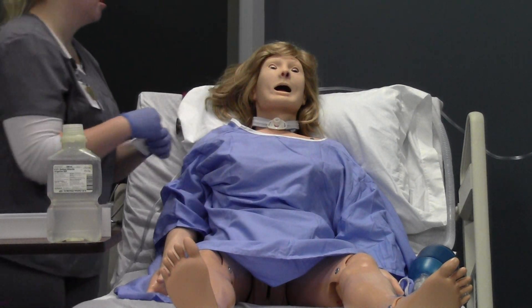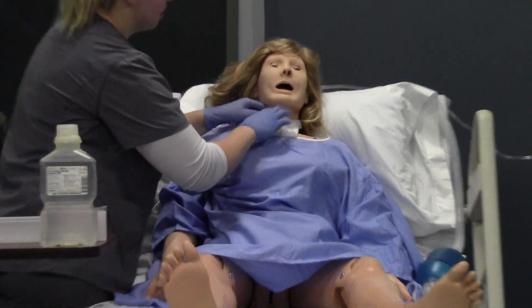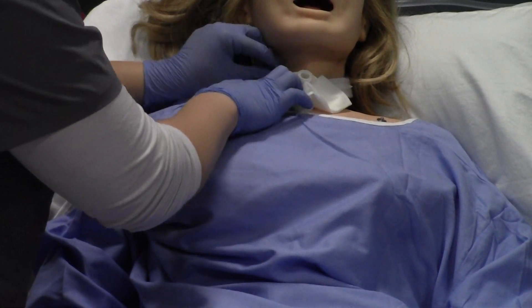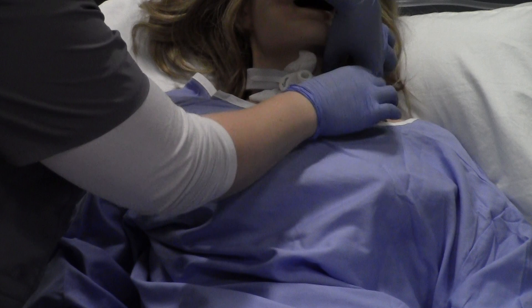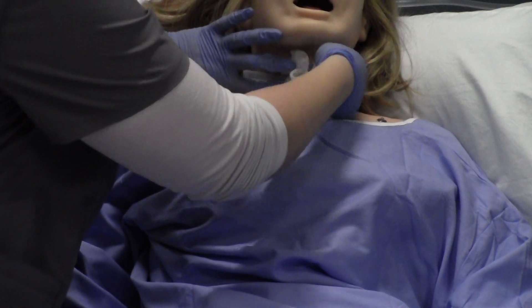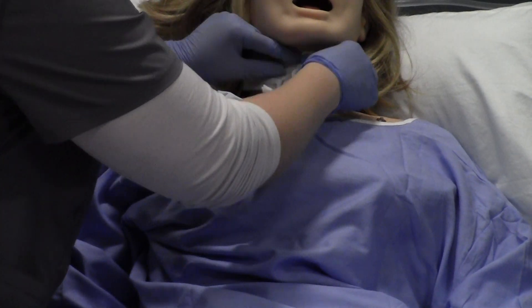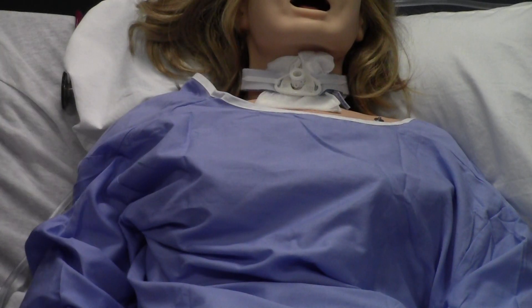I'm going to put my clean trach dressing underneath. My partner holds one side of the faceplate while I slip the dressing under, then they switch and hold the other side while I slip the other side under.